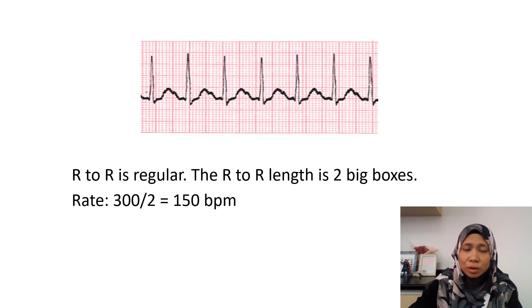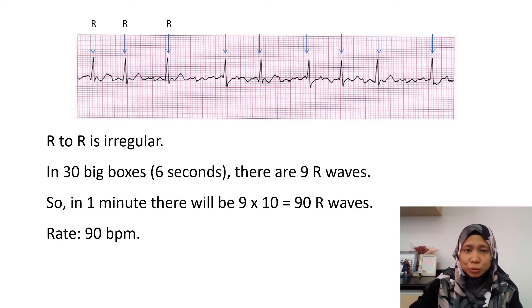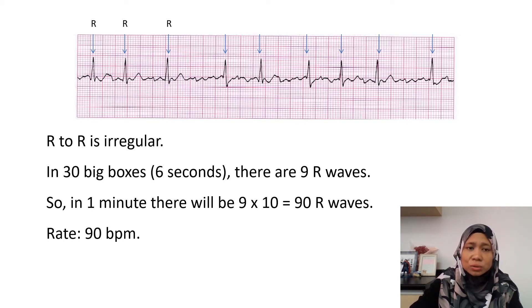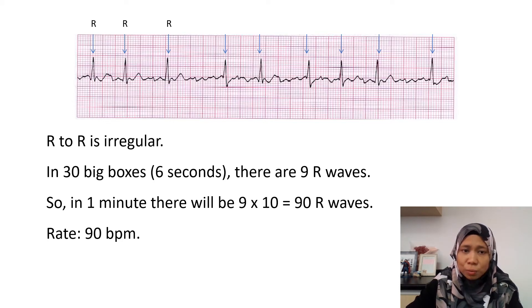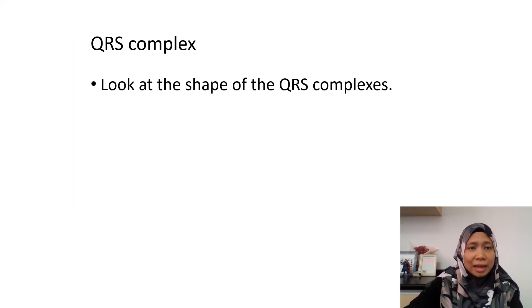Looking at this strip, the R-to-R is irregular, so we count in 30 big boxes. In those 30 big boxes we can see there are 9 R waves. So in one minute there will be 9 times 10, which equals 90 R waves. Therefore the rate is 90 beats per minute.